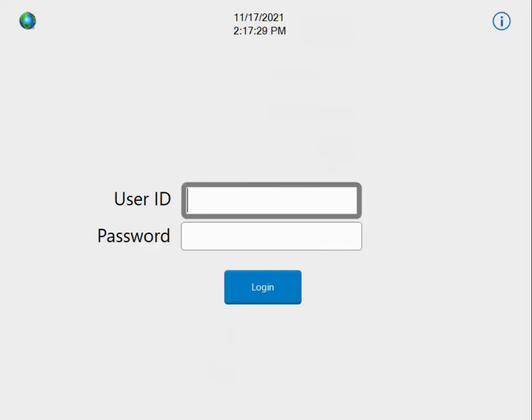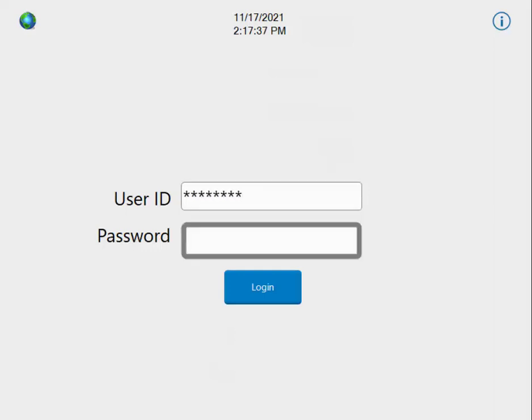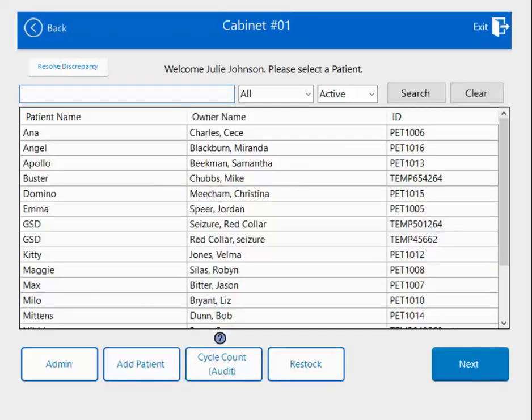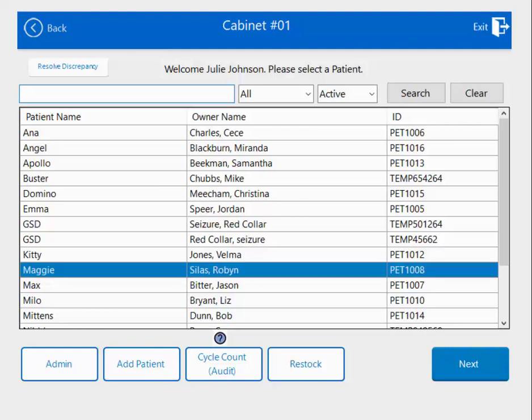In this video, I'm going to show you how to record a waste. First thing you're going to do is log in, and you can either use your manual credentials or your fingerprints. Once logged in, you're going to choose the patient you need to waste the medication for.